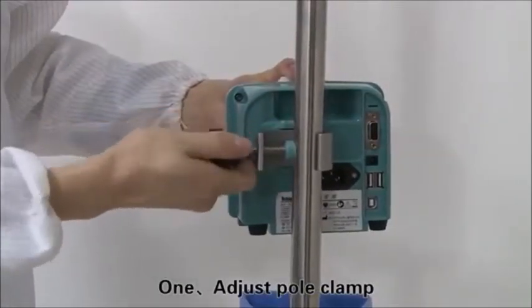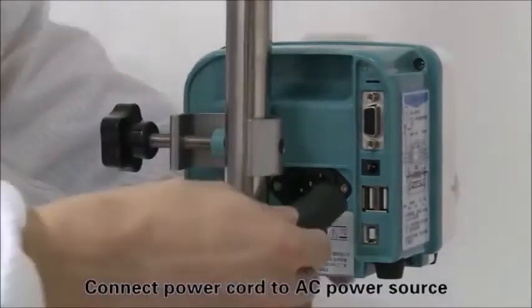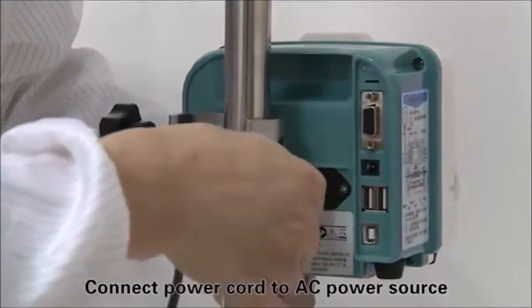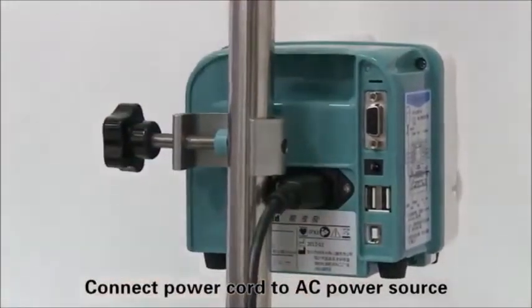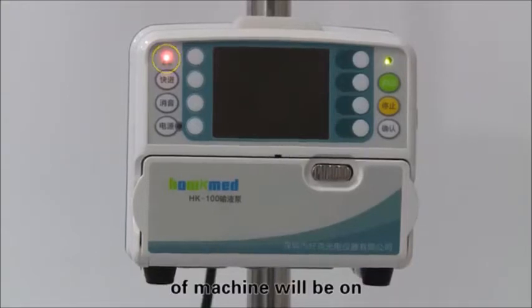Adjust pole clamp and fix the machine on the IV pole. Connect the power cord to the AC power source. The AC-DC indicator light on the top left of the machine will turn on.